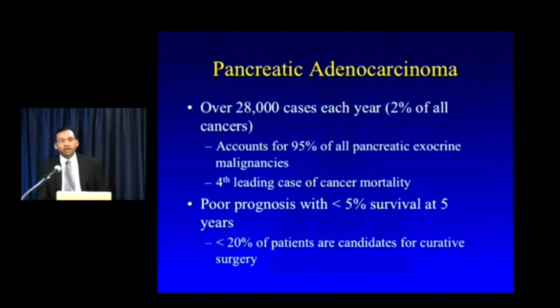Now, why don't we start by talking about what I consider the most important pancreatic neoplasm, and that's pancreatic adenocarcinoma. Now, this is something I see all the time, right? I work at probably the biggest pancreatic cancer referral center in the country. I see dozens of these cases every week, and I will tell you, having a systematic, algorithmic approach to these cases is critical in terms of making sure you don't miss anything and that you're really picking up on those subtle abnormalities that your surgeon wants to know about.